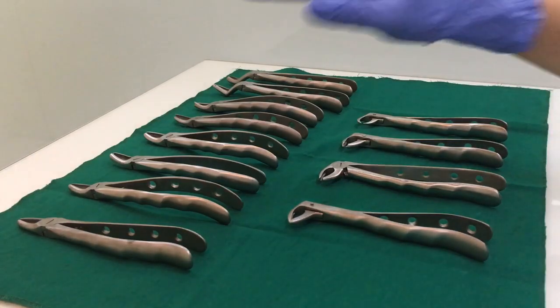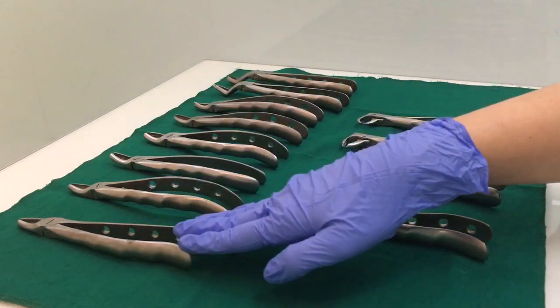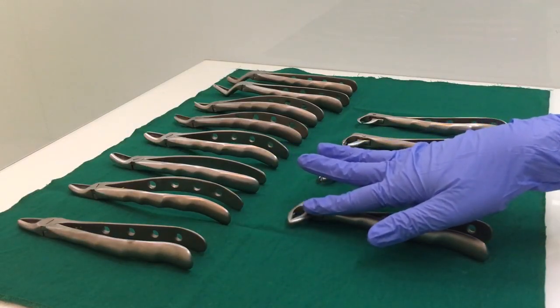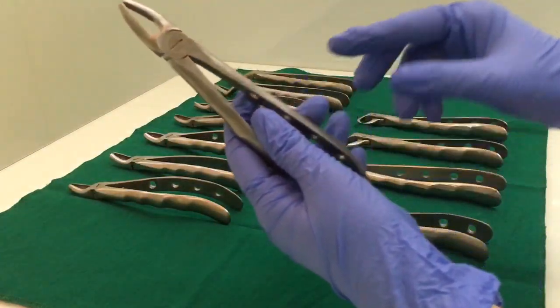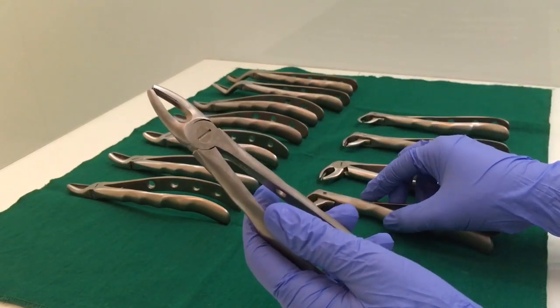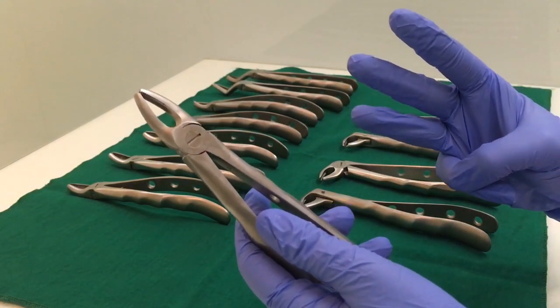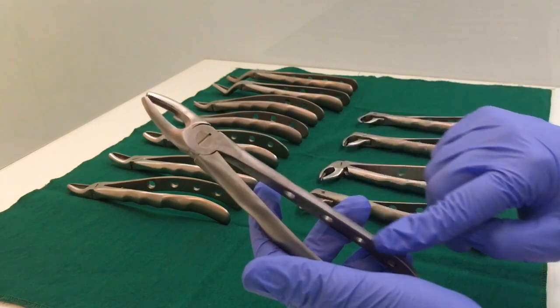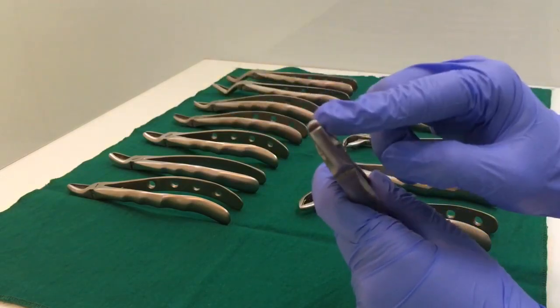The basic difference between the upper forceps and the lower forceps is that the upper ones are always straight, and the lower ones always have the beaks at right angles — at 90 degrees. Any forceps, whether upper or lower, will have three parts: the beaks, the hinge or joint, and the handle. Most of them will be differentiated according to how the beaks are.